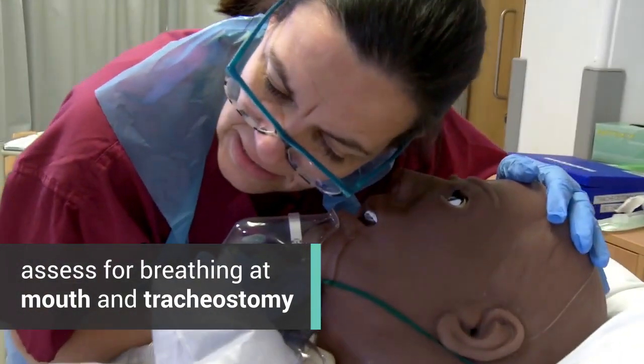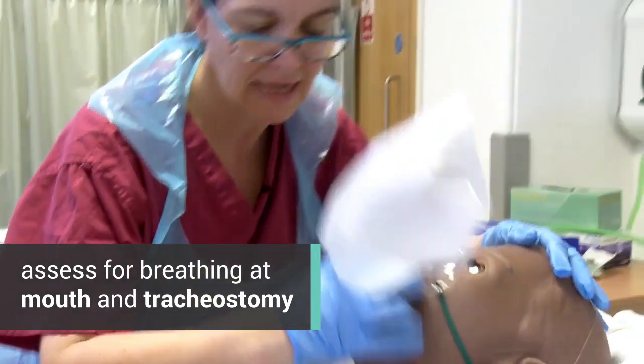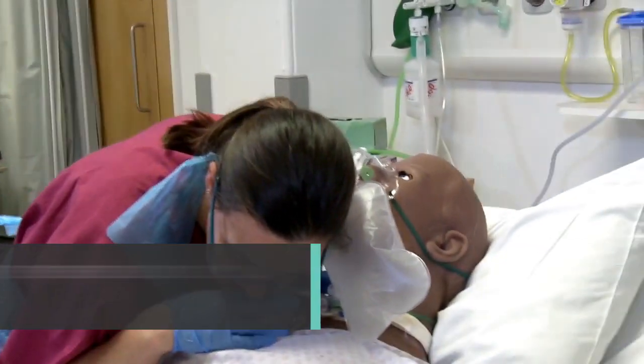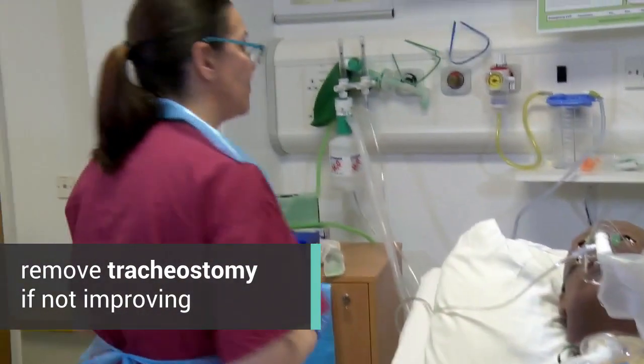It's just going to see if you're breathing there. Is he breathing? Barely at his mouth. I don't know if it's shifting from the tracheostomy. We need to remove that tracheostomy tube now. I can't feel it shifting there at all, so the tube needs to come out.